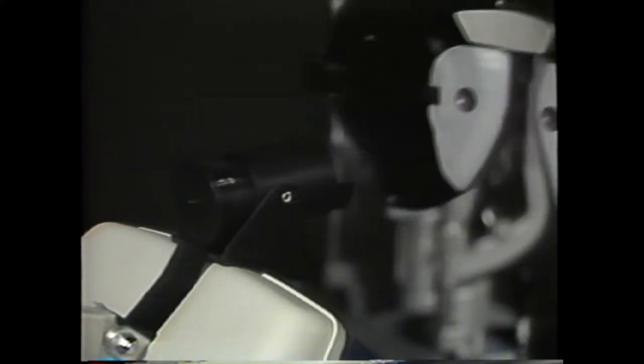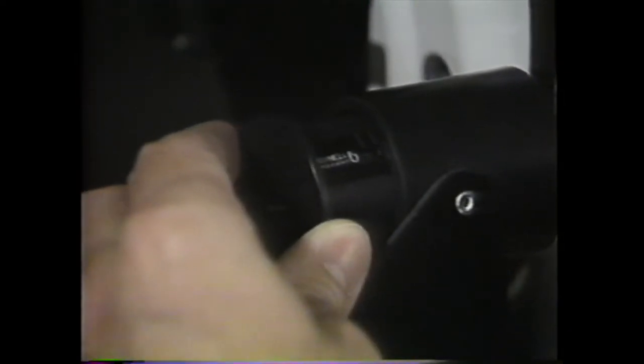The spherical refractive error — that is, the amount of nearsightedness or farsightedness, myopia or hyperopia — can be adjusted by moving the back portion in or out according to a scale marked on the device.